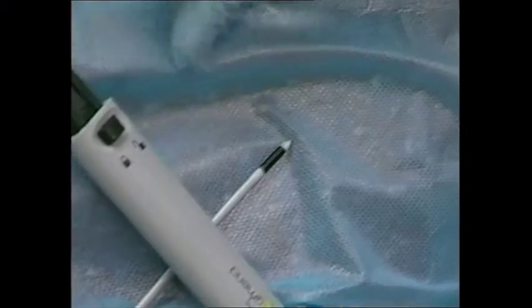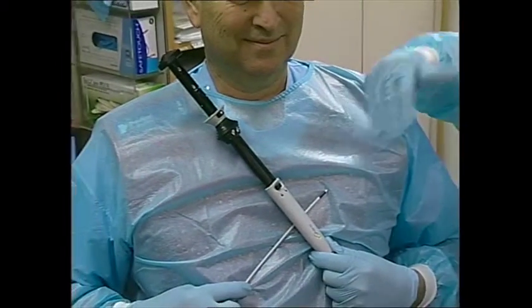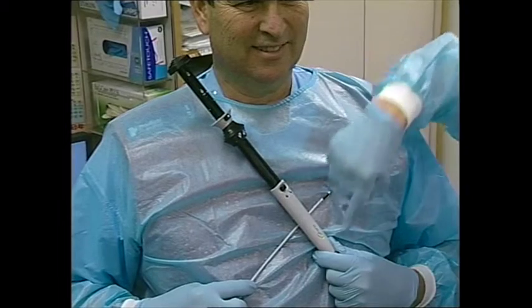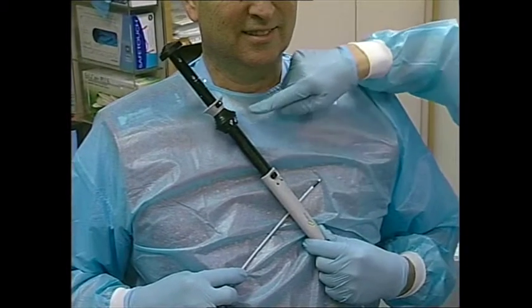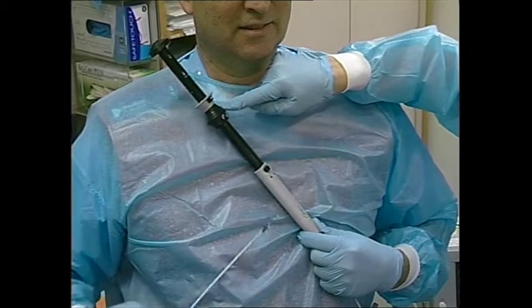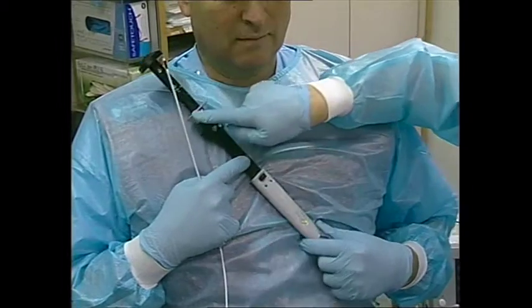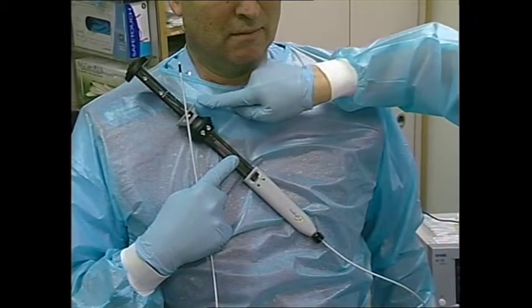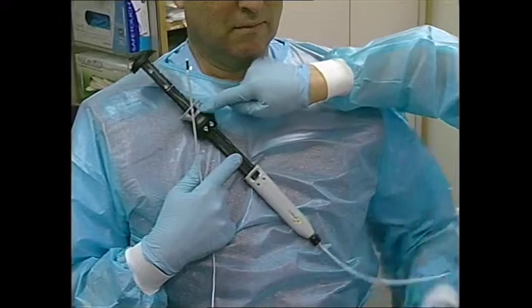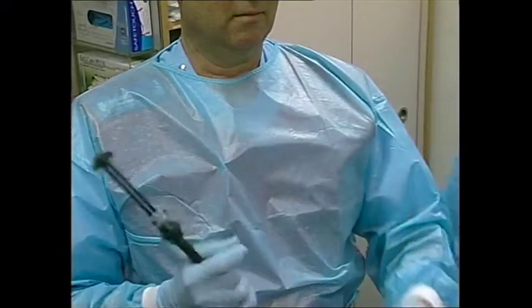Now, I'm going to show you this on the scope, but there are two components to this. This is all designed similar to an FNA needle. It's luer locked onto the scope, and you advance the sheath using this first hub here by advancing that, and then you deliver each of the flanges, maybe bring that down a little bit, each of the flanges on the second hub here. Here's the second hub. Let me just show you that after it's luer locked to the scope, though.